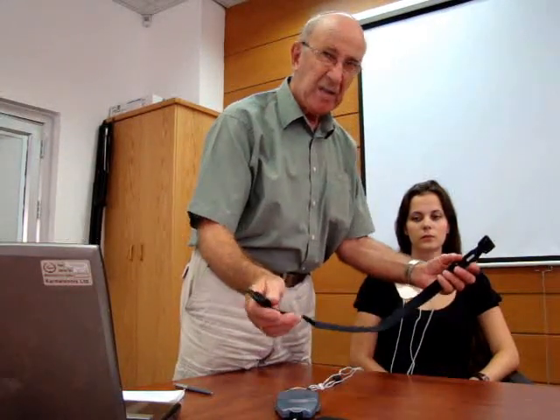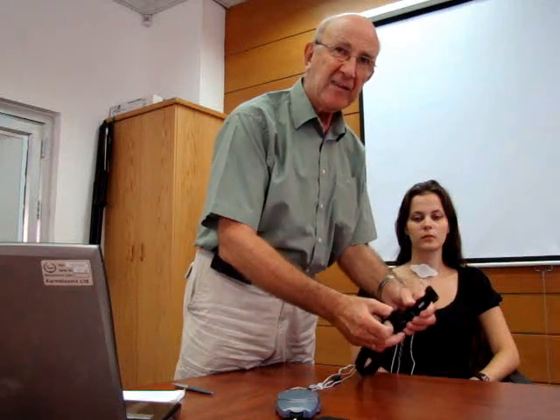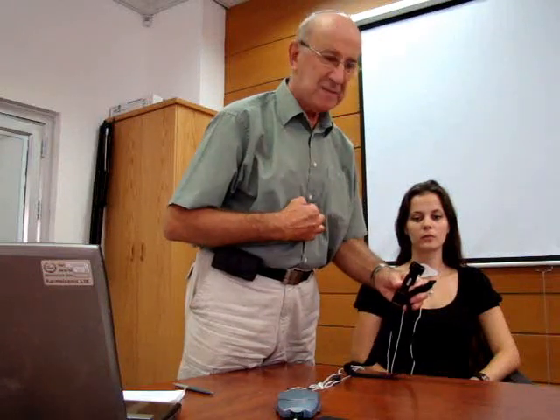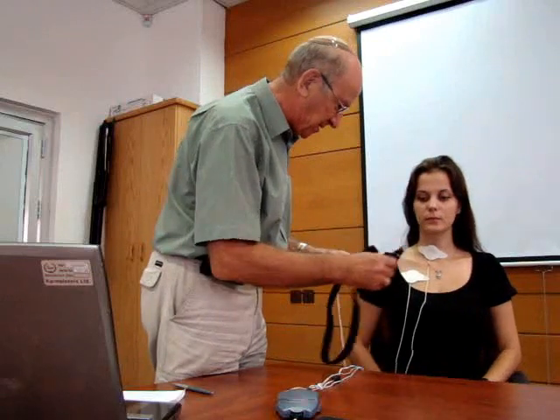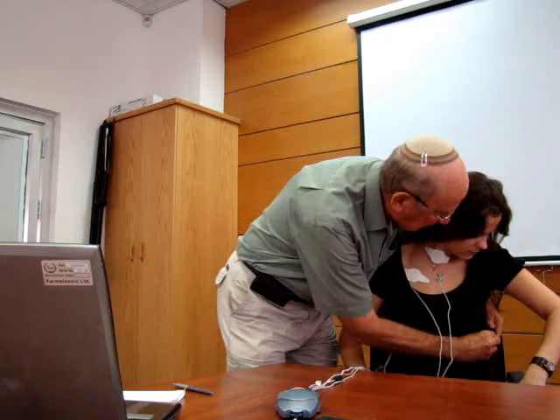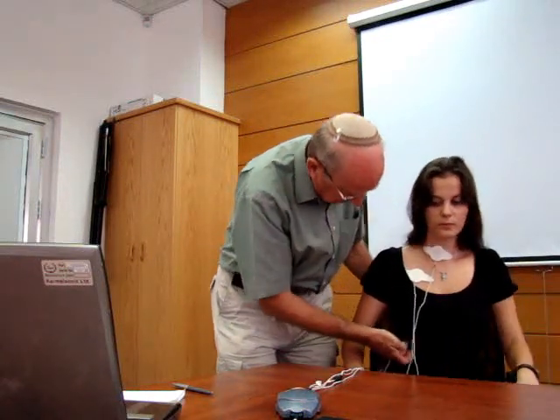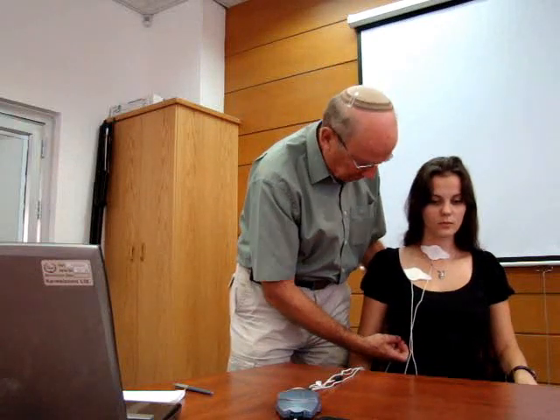Respiration is recorded using a respiratory belt, which is placed around the chest at the level of the insertion of the diaphragm. This is the level of the xiphoid, and in a woman it's placed just below the level of the breast. I put this around here and lift it together. It needs to have a reasonable amount of tension so it doesn't slip up and down — a little bit of tension, but obviously not too much, making sure that it doesn't slip.